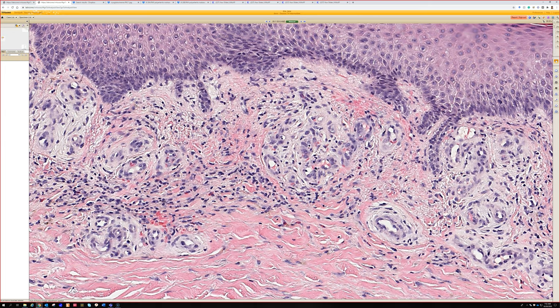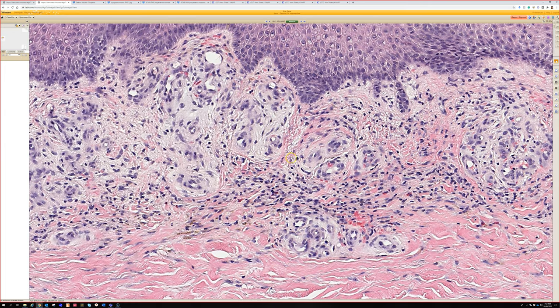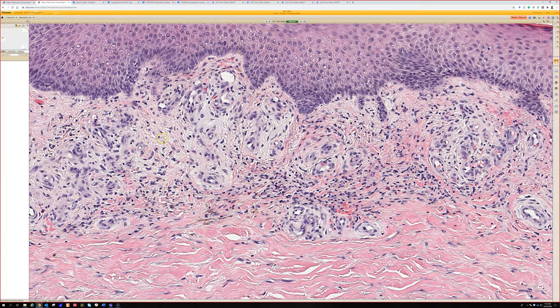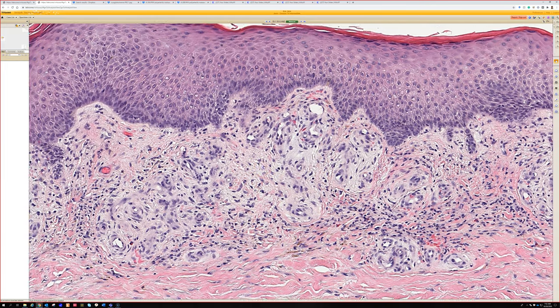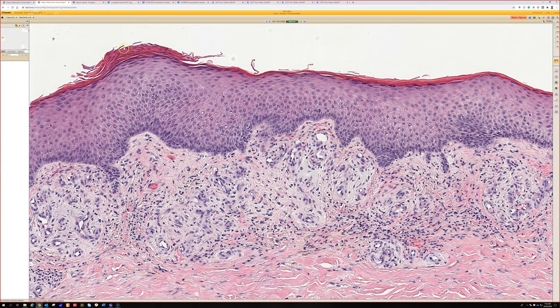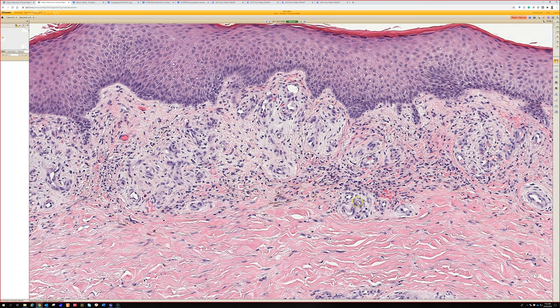They don't often have a ton of inflammation. Remember that a lot of times people have stasis and then they get stasis dermatitis — which is probably what's going on here because there's spongiosis over it. When I see spongiosis on the lower leg, there's often stasis under it. It could be stasis derm, could be contact plus underlying stasis — any combination of spongiosis plus stasis, and how much the stasis is contributing to the dermatitis itself is variable.